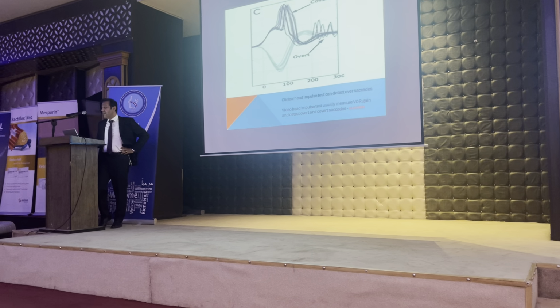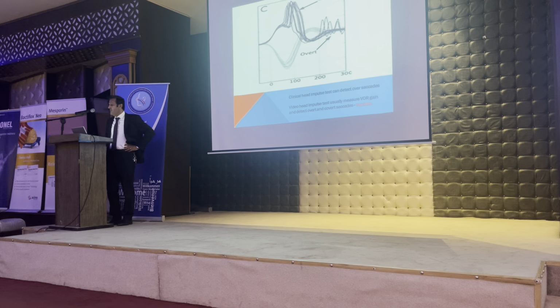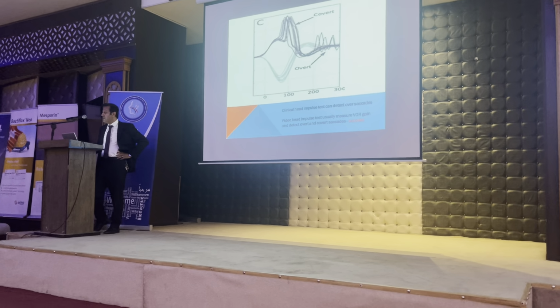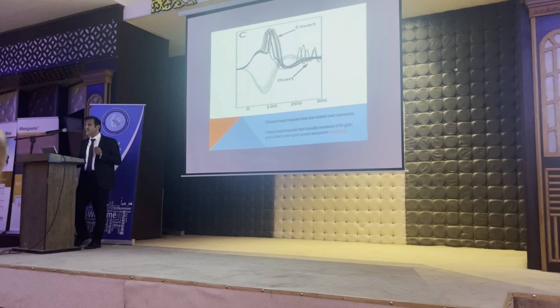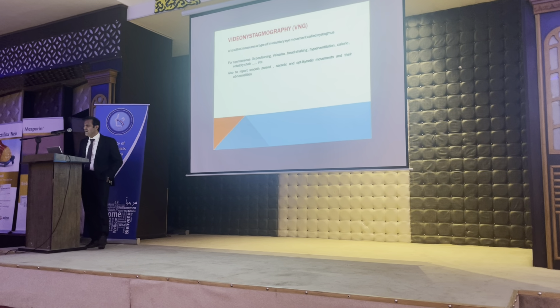Also, we can measure the gain of the vestibular reflex. So this is a success of vestibular testing: the video head impulse test can detect all these extra things that the clinical impulse test cannot.